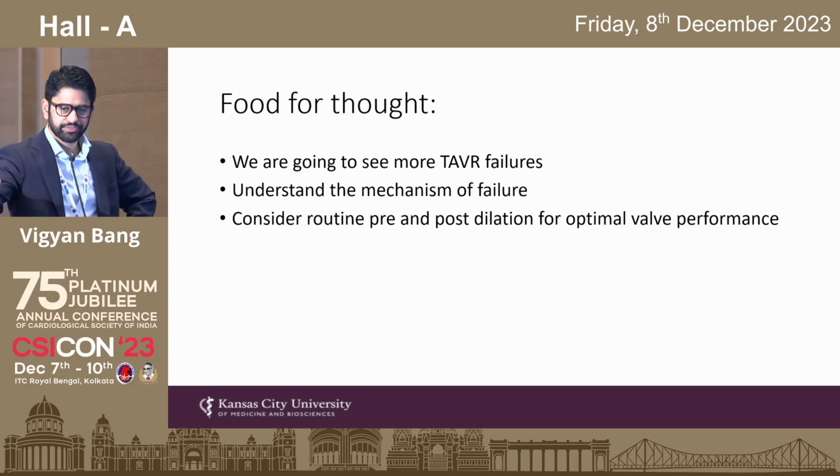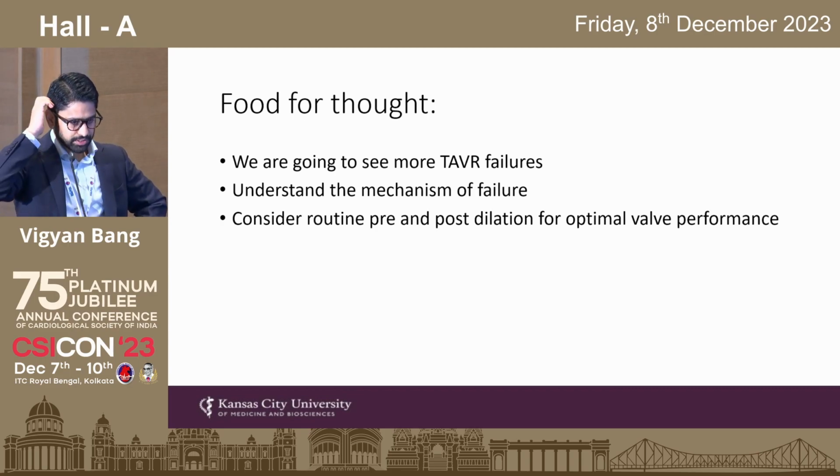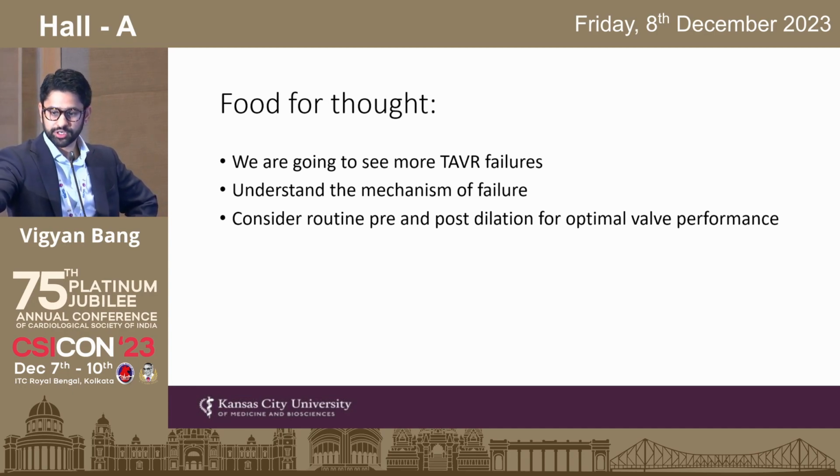It's very early in TAV data and in the era of low-risk aortic valve replacement with TAVR. But here are my early thoughts: we are going to see more TAVR failures, particularly with TAVR now being approved for low-risk patients. And when we are treating these patients, understanding the mechanism of valve failure is probably the most important thing in trying to address the underlying mechanism.